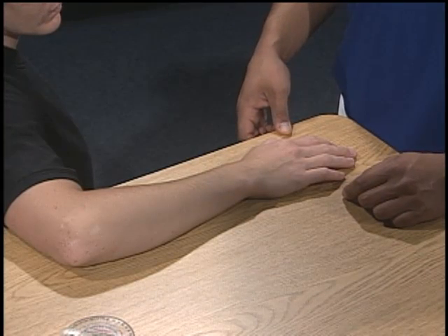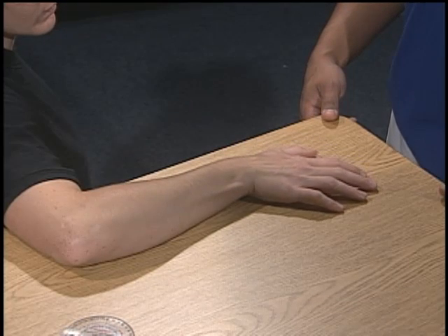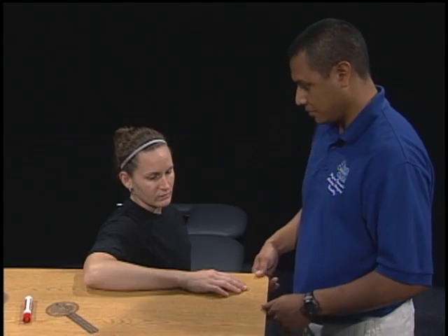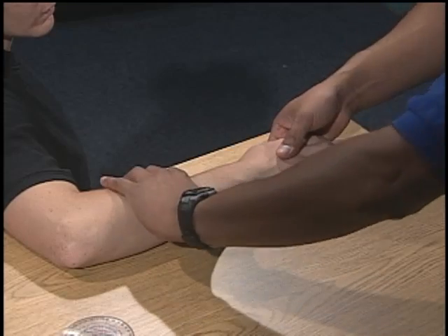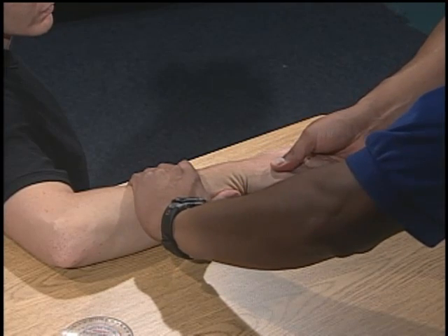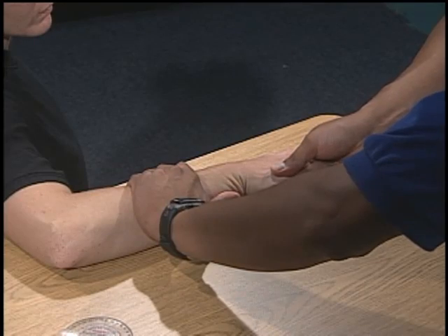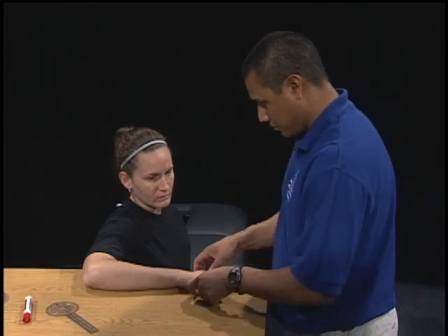In patient-appropriate language, ask the patient to ulnarly deviate the wrist. Assess the forearm for supination or pronation and the elbow for flexion less than 90 degrees. Ulnarly deviate the wrist by moving the hand towards the fifth digit. Maintain the wrist in 0 degrees of flexion and extension and avoid rotating the hand. Stabilize the forearm to prevent supination and pronation and elbow flexion less than 90 degrees.